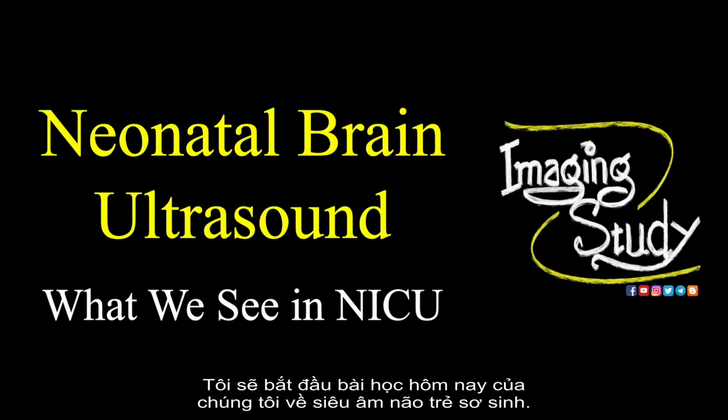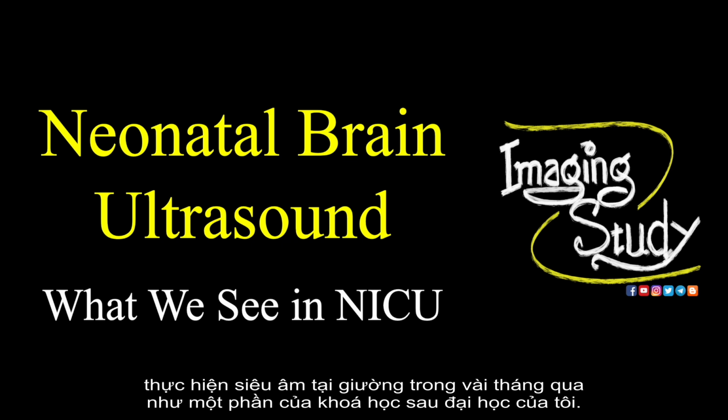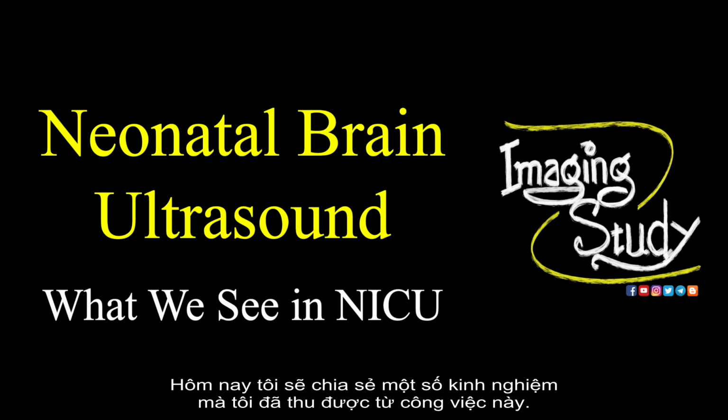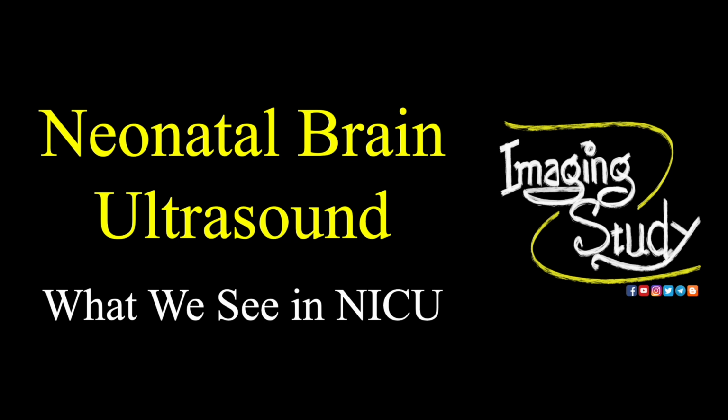Dr. Mahin from Imaging Study is going to start today's session about the neonatal brain ultrasound. I had a great opportunity to work in the neonatal intensive care unit doing portable ultrasounds for the last few months as a part of my postgraduate course. Today I'm going to share a few of the experiences that I have gained from doing that job. I'm going to share 10 cases today with a short discussion of each. Hopefully that will be helpful for you.